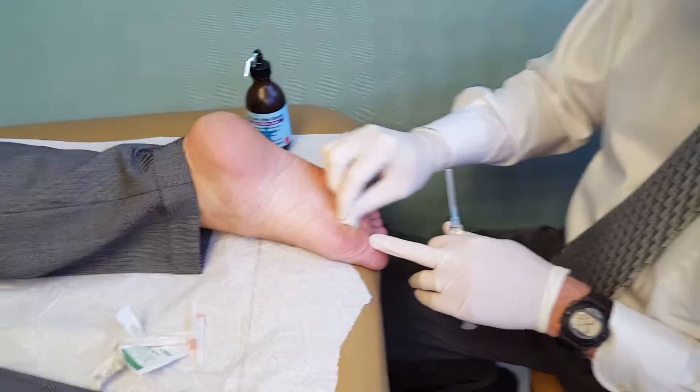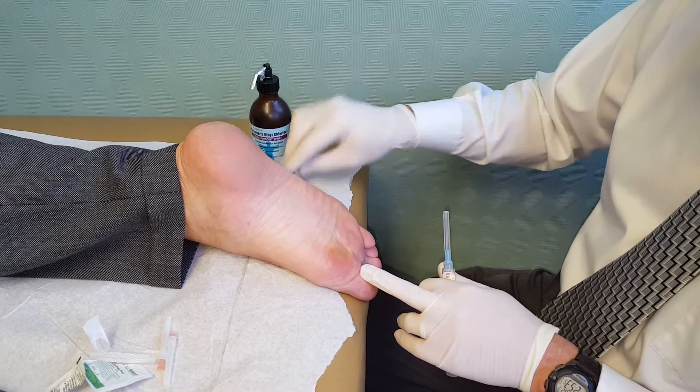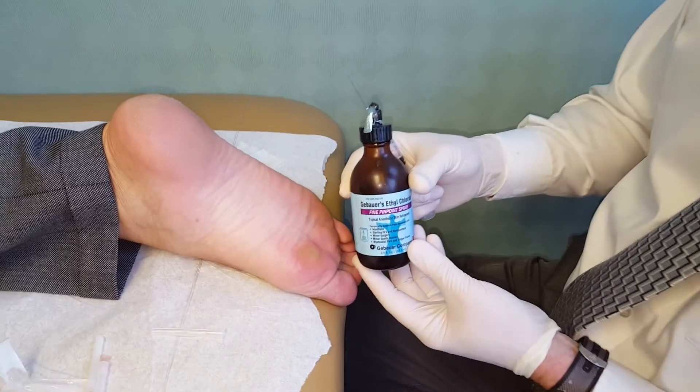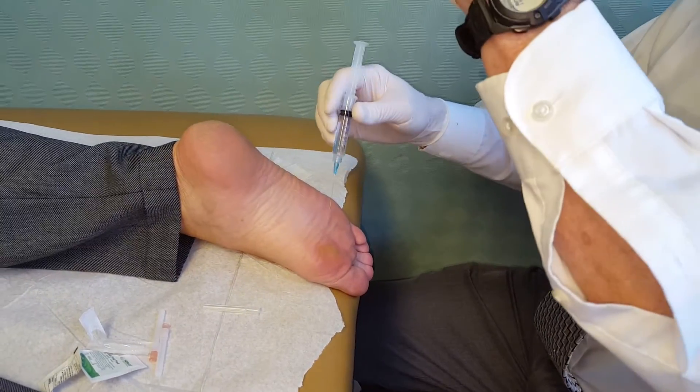We're going to be doing a needling for Veruca, plantar aspect, first metatarsal, right foot. And we're going to use this ethyl chloride spray to temporarily numb the skin before the injection.